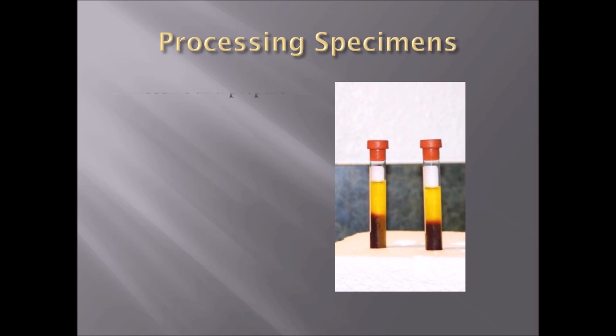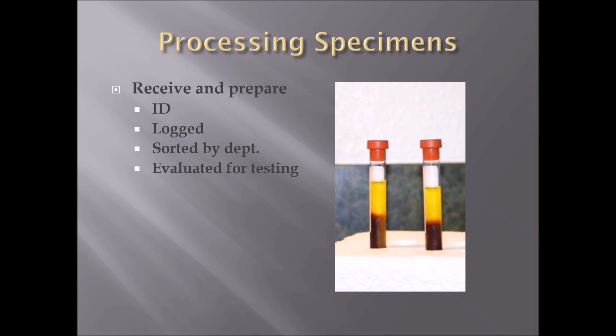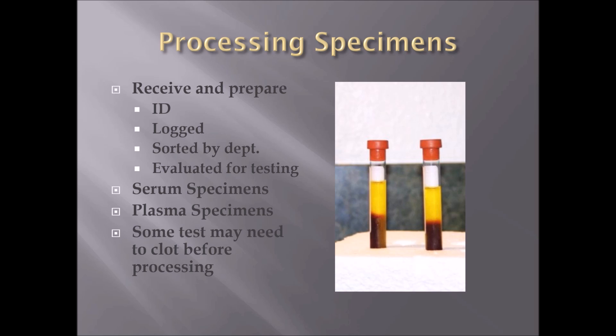When processing specimens, we need to receive and prepare them. Check the ID on the tubes and labels to make sure everything is accurate before receiving and preparing. Log everything accordingly if required. Sort by department — chemistry, hematology, microbiology — if required. Evaluate specimens to ensure they are in good condition and will meet lab requirements. Serum and plasma specimens may require special time frames before testing or preparing for shipment, and some tests may need to clot before processing. Check your hospital or laboratory policy and procedures on processing and receiving specimens, as each one will be different.